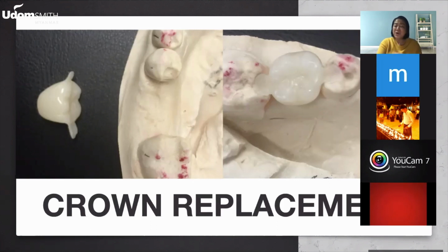Now, however, on these cases, I do not suggest you do it if you are just starting Edelweiss. My suggestion to a lot of dentists who want to try Edelweiss and do it right is to do something simple first. Try to build your capability of handling and doing Edelweiss first before you go to complicated cases.